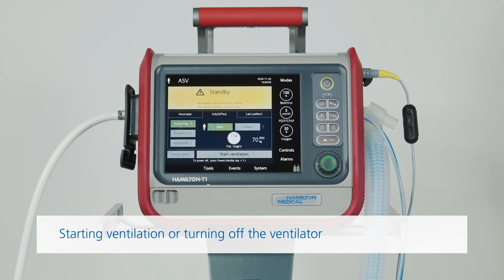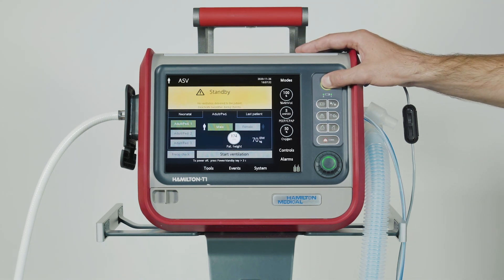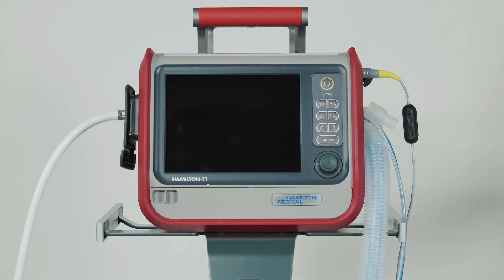Once you've finished the pre-op checks, the ventilator is ready to use. You can set up the ventilator for a particular patient and start ventilation, or you can turn off the ventilator and keep it stored away, ready for use. All the test results of the pre-operational checks will remain stored in the memory, even when the ventilator is turned off. But make sure that the setup you calibrated is not changed or altered while the ventilator is in storage. To turn off the ventilator, press and hold the power standby key for about 3 seconds. It's best to keep the ventilator connected to its primary power source to maintain the battery charge and extend the battery's life.